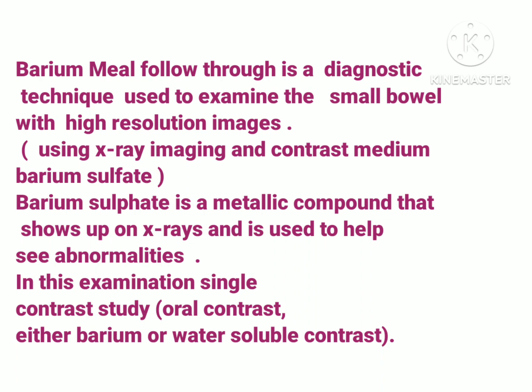Now, barium meal follow through is different from barium meal. In barium meal follow through, we can visualize the small bowel completely, means fully. So all the parts of the small bowel are visualized in this examination, and the parts of small bowel are duodenum, jejunum and ileum. This examination is a single contrast study because only one contrast is being given to a patient, that is positive contrast barium sulfate orally.